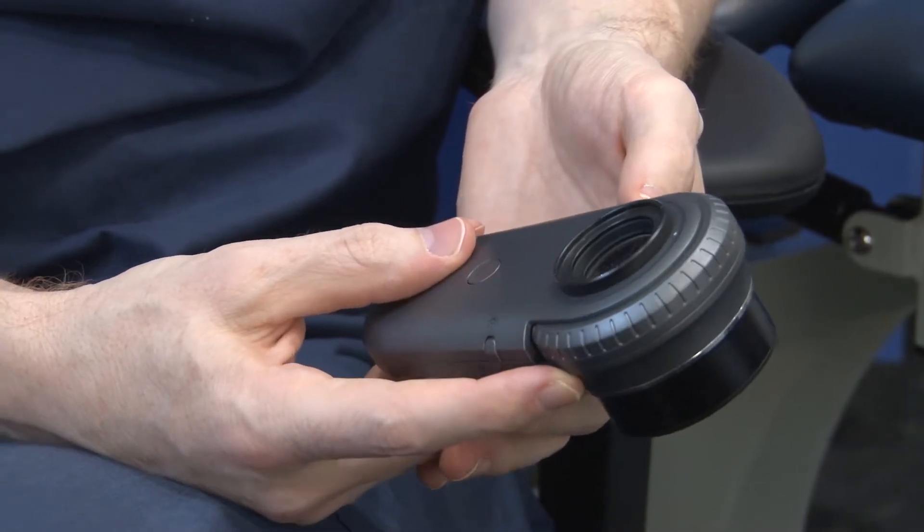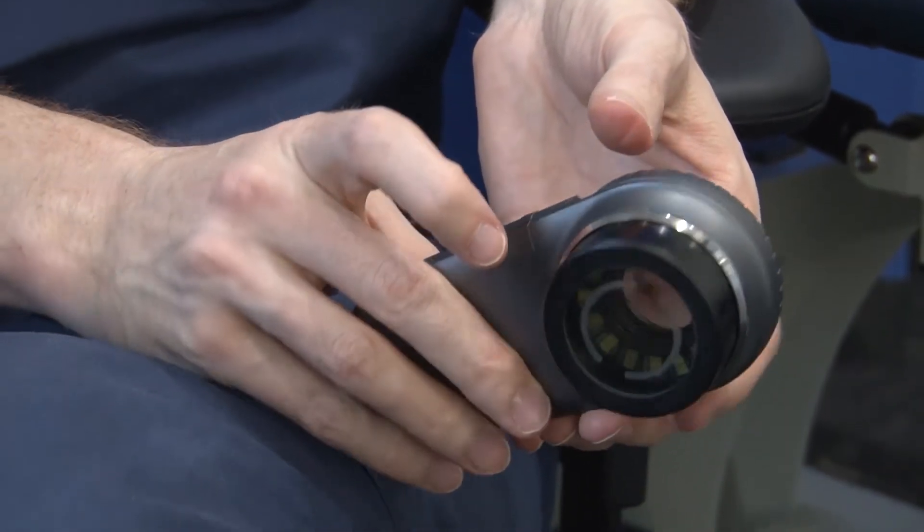This dermatoscope I'm using at the moment is an Eluko brand. It's got a few features you probably saw in the video of my skin check that I was doing.